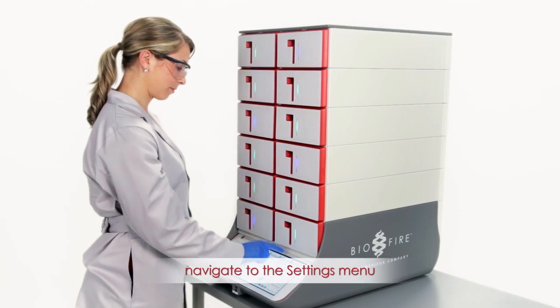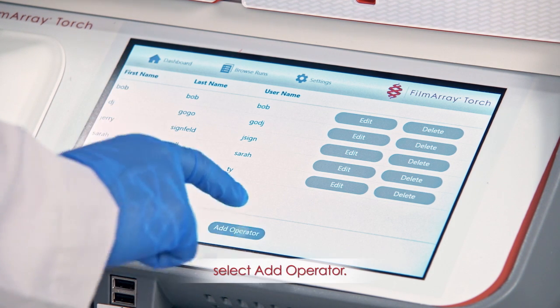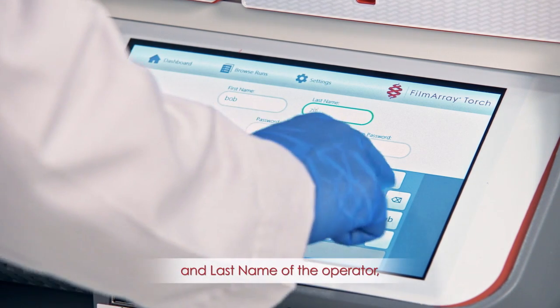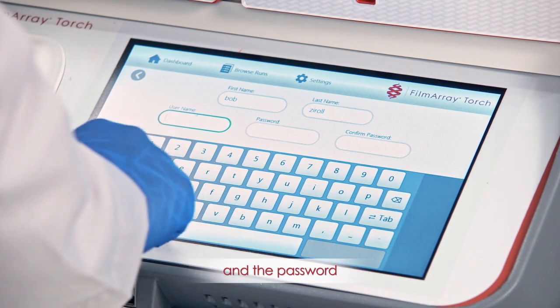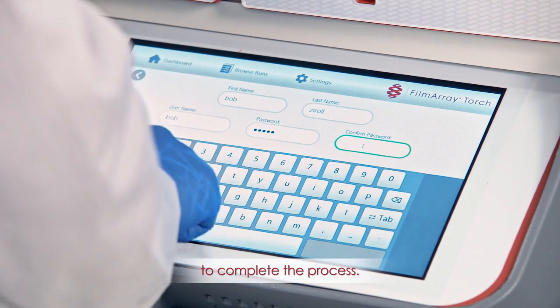Alternatively, navigate to the Settings menu and select Operators. When the list of current operators is displayed, select Add Operator. Enter the first name and last name of the operator, a username, and the password in both the Password and Confirm boxes. Select the green Save to complete the process.